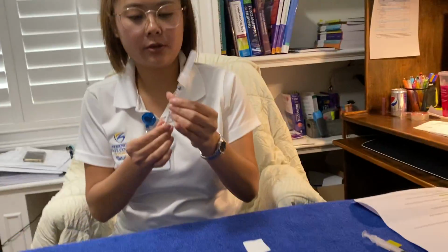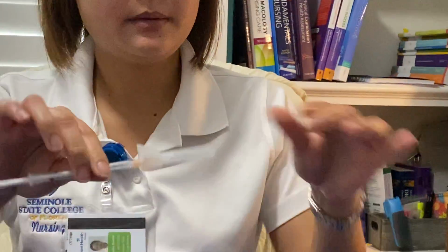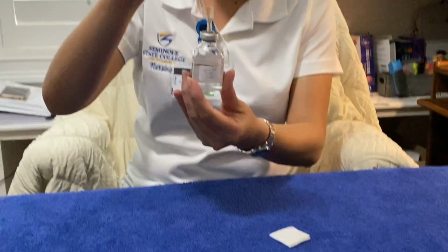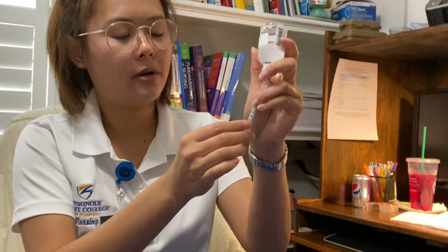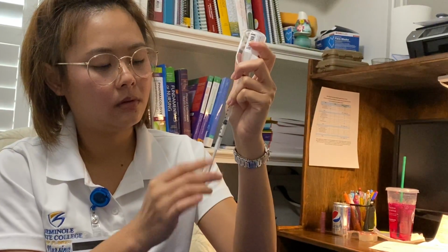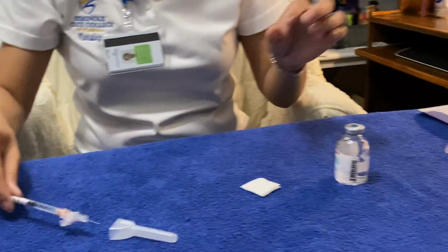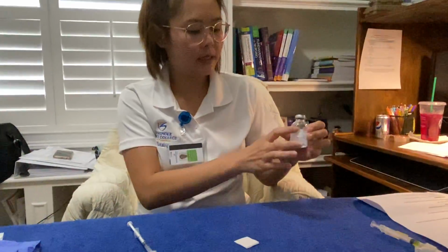Okay, exercise your plunger. Pull back 0.5 as prescribed. And then carefully inject the air in the vial, where all the air is on the top. Invert the vial. Pull back 0.5 ml. Make sure you get 0.5. Okay, got 0.5. Make sure you don't have any bubbles inside the syringe. Scoop method. This one is a multi-dose vial, so keep it for next time, and it has been labeled.